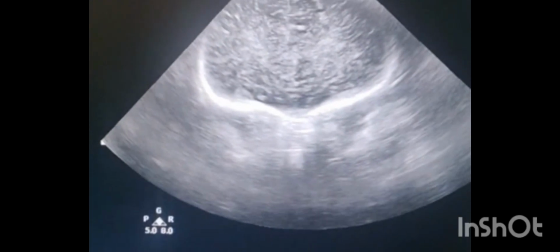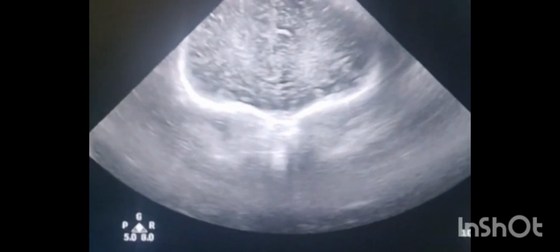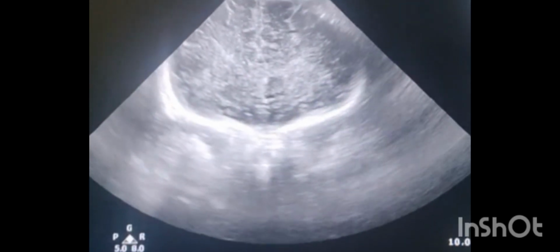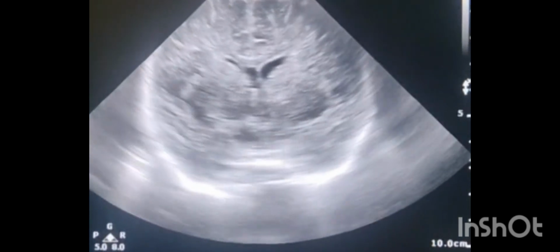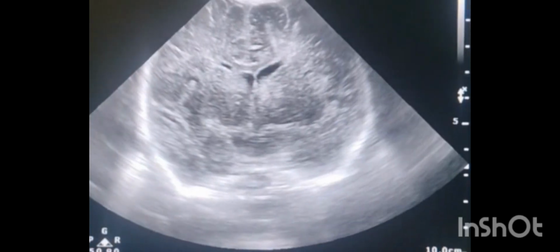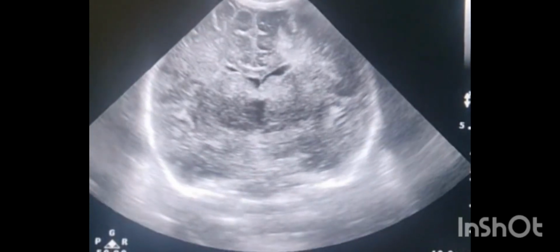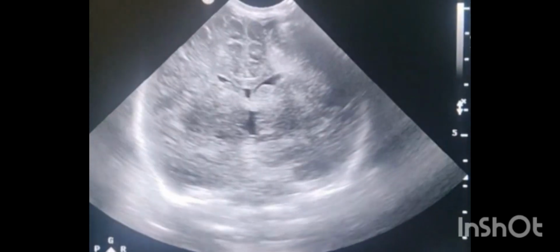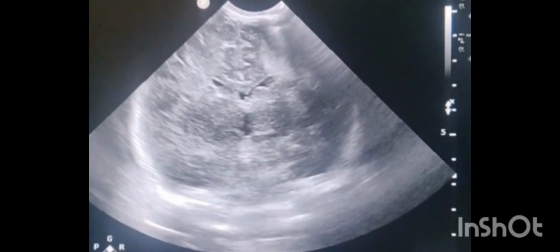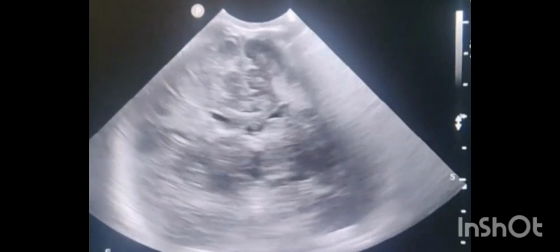Now, if you look at this image, I'm just going through the brain scan. This is the ultrasound brain, coronal section. And then I'll do an anterior to posterior sweep. You see the ventricles here. Then on the left side, you can see a hyperechogenic area around the frontal horn. It looks fan shaped. It is a hyperechogenic shadow.